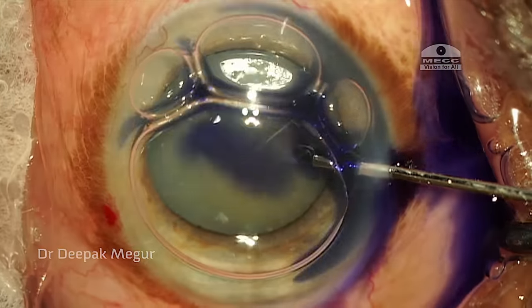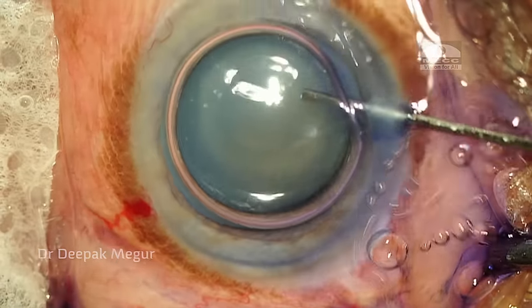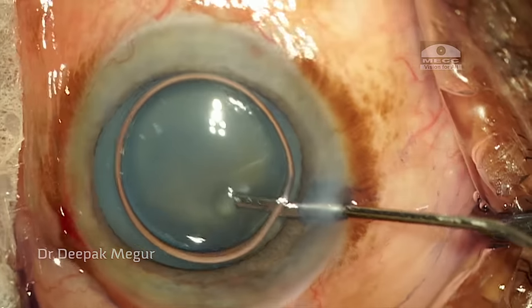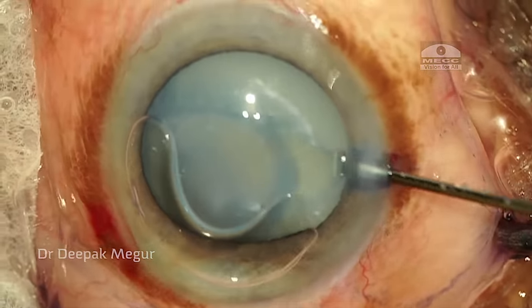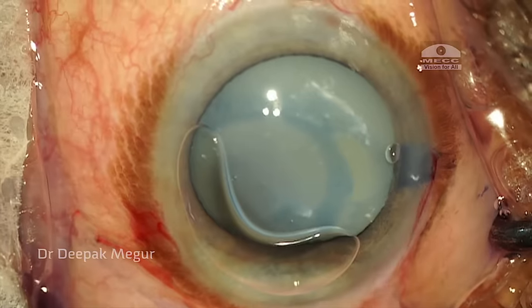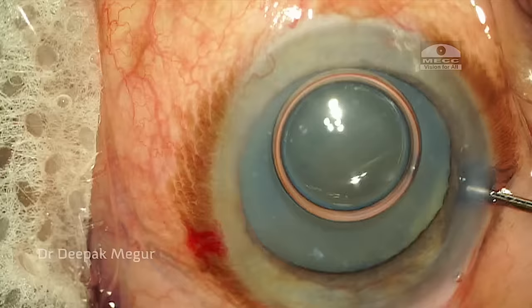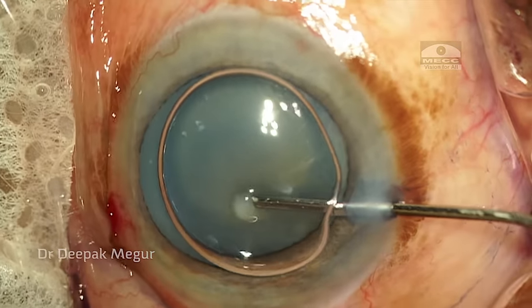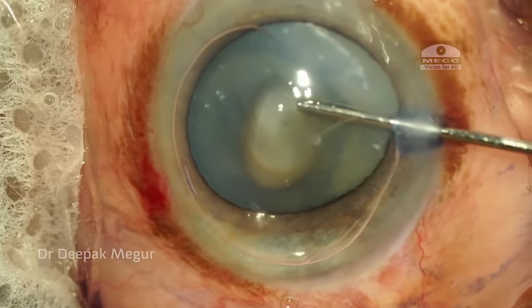After making two side port incisions, I am staining the anterior capsule with trypan blue and I am planning to inject a dispersive OVD — and suddenly this happens. The entire capsular bag complex moves anteriorly. I can see the equator of the lens in the anterior chamber. This is how it looks in slow motion replay: the equator of the lens just pops up into the anterior chamber.